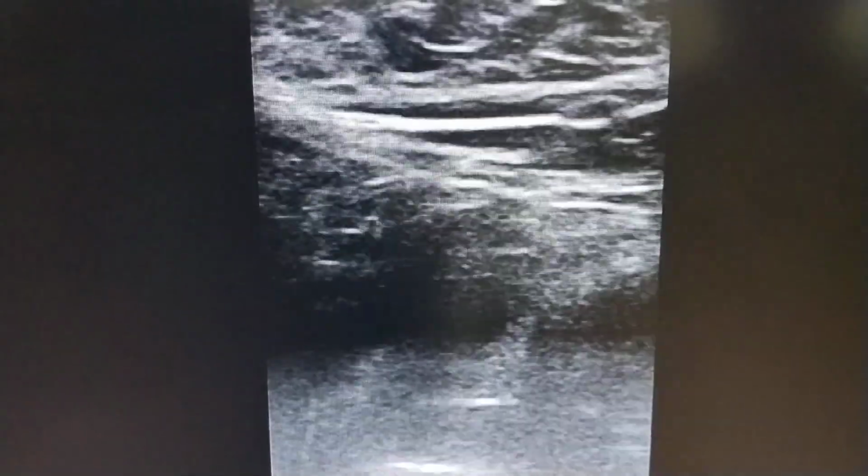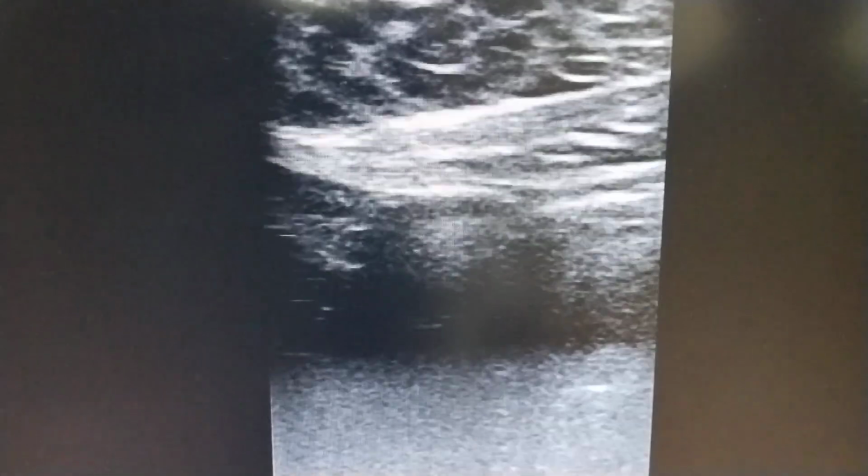Last time I told you to follow the inferior epigastric artery from the umbilical region. Now I am going to tell you about another landmark that can be used to differentiate between the direct and indirect inguinal hernia.